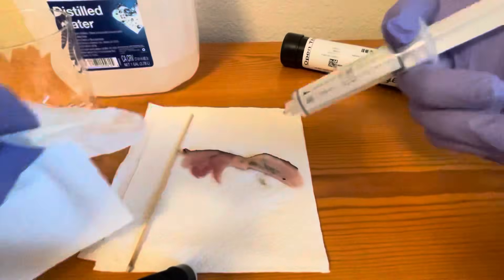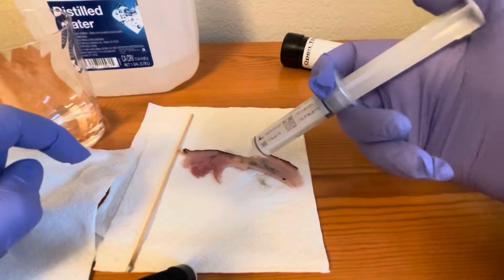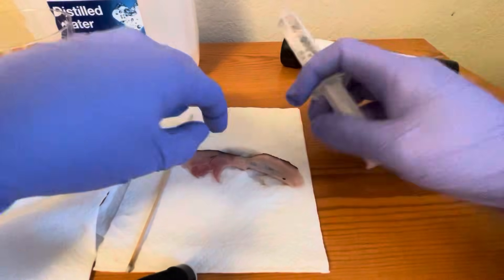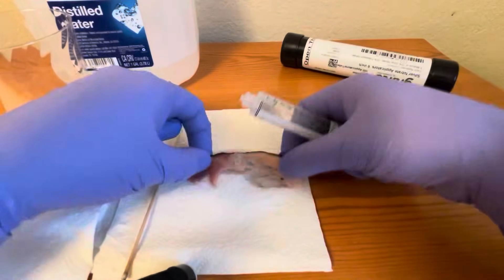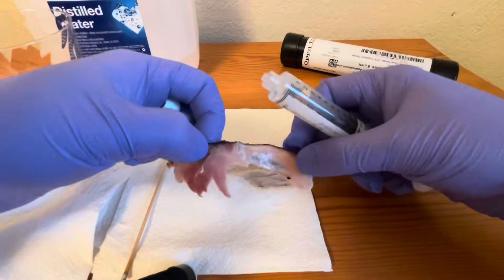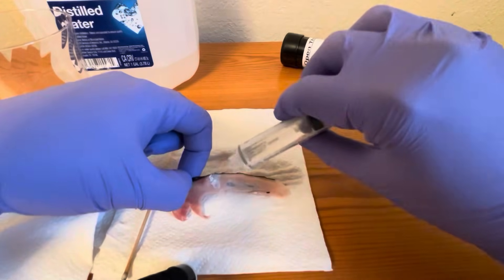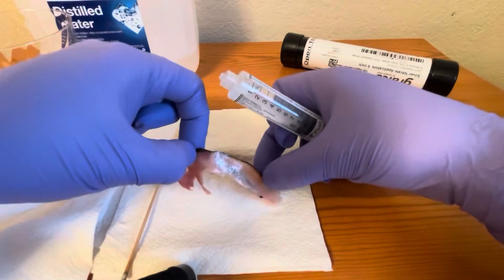To stop activating the silver nitrate, you can either get your normal saline solution, dab it on the tissue to stop it, or you can just wash it right off. As you can see, it turns silver — that shows you that the silver nitrate is deactivated using the saline solution.